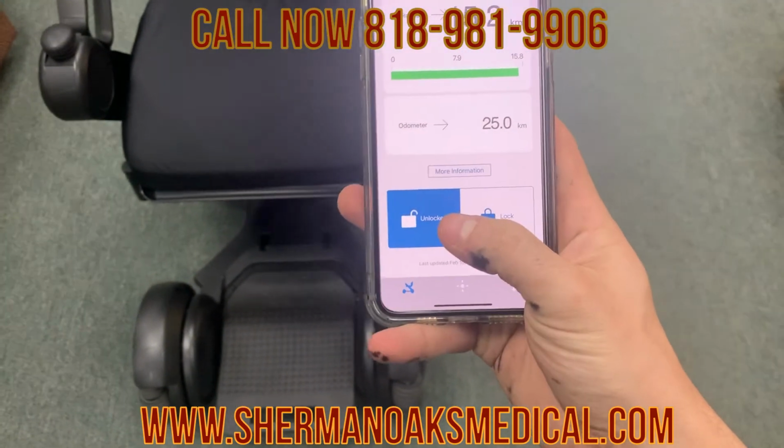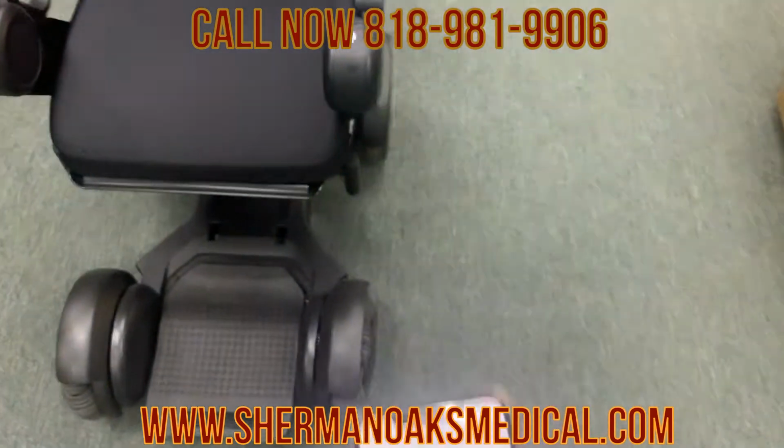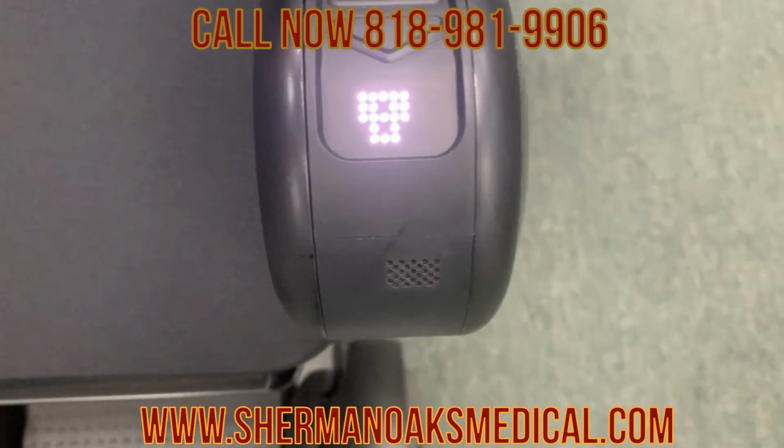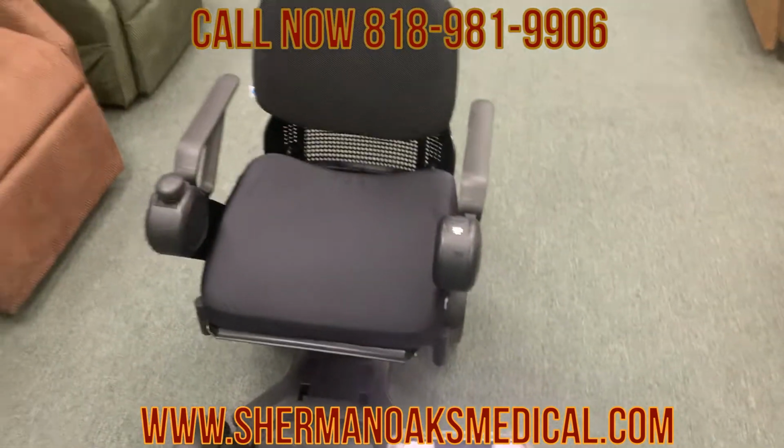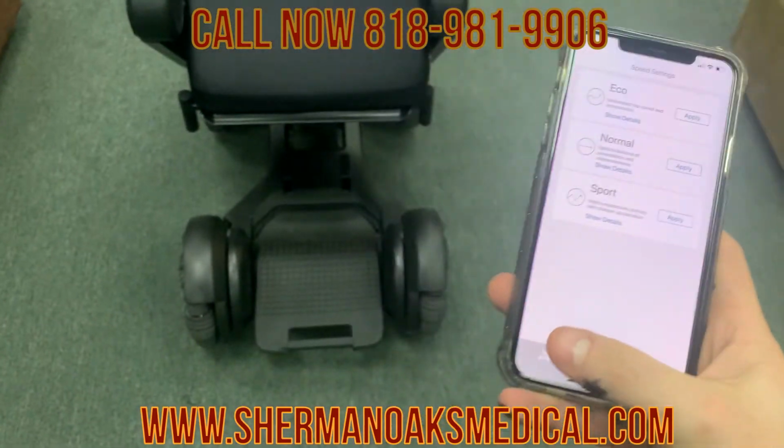You're able to lock and then unlock your device. So if our device goes into a locked mode here, then you can see on the device it instantaneously locks. That way no other users are able to come and get the device. And then we can unlock it with a touch of a button.